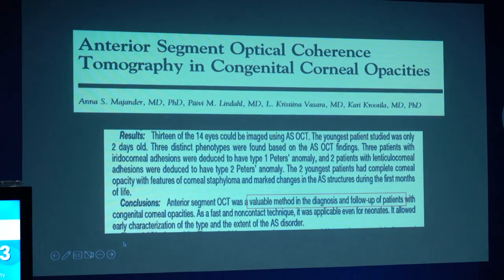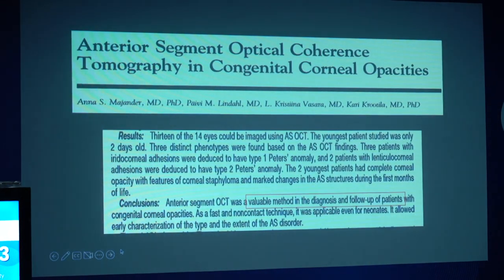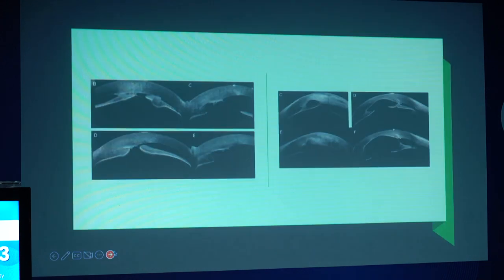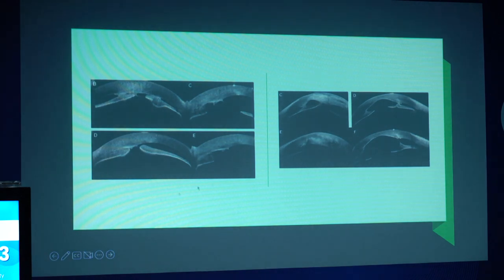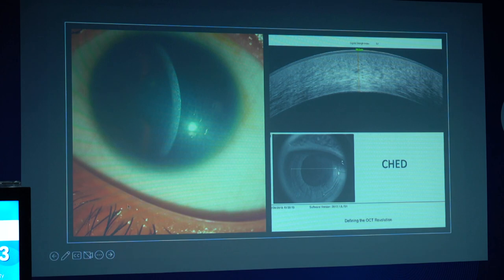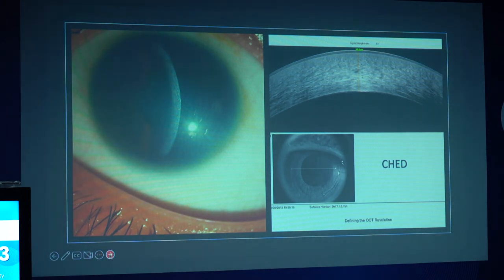In congenital corneal opacity, OCT plays a vital role in diagnosis and follow-up, especially in patients with Peters anomaly, to differentiate associated lenticulocorneal or iridocorneal adhesions. If you look at this OCT, you can make out that the iris is adhering to the posterior surface of the cornea. Although UBM would be necessary to look at lenticular adhesions, OCT is a useful screening tool. This is also a patient of sclerocornea where you see diffuse stromal thickening and hyperreflectivity in the posterior stromal layers.